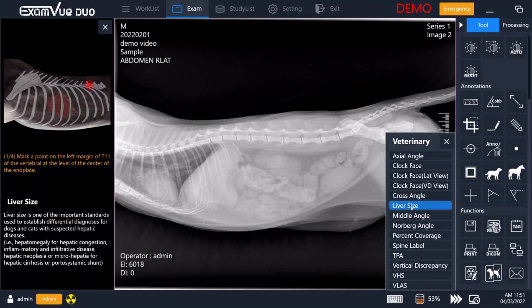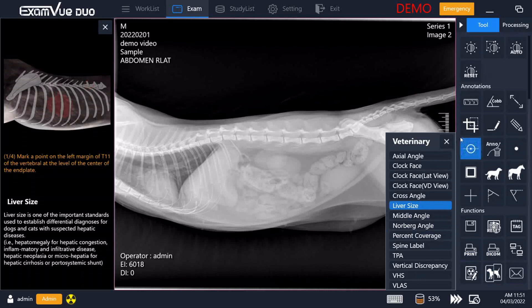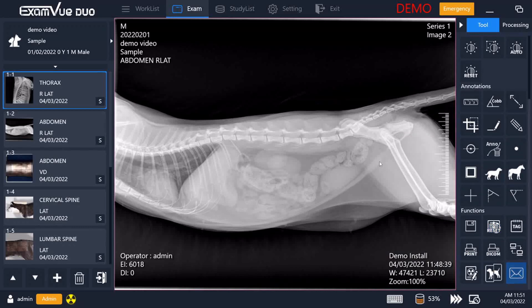There will be a blinking dot on the picture up in the top left that will show you where your next click should be, and then a written description below that of exactly where you are marking. You can also email directly from the software simply by clicking on the email button, which will bring up an in-app email function that you can connect to your own email server and email directly to your customers.